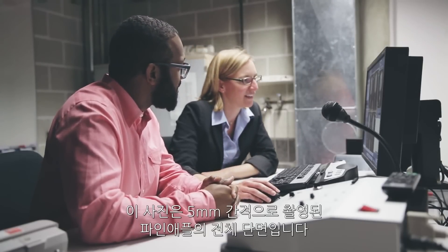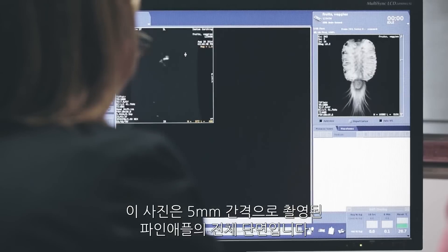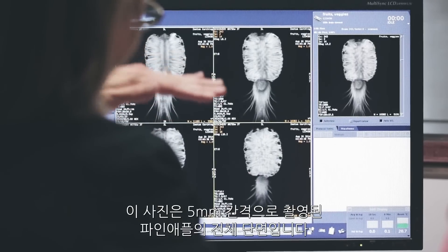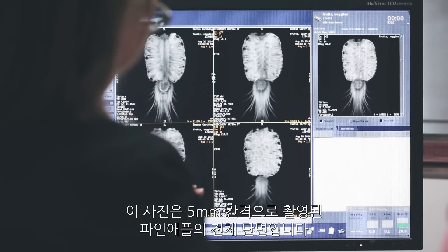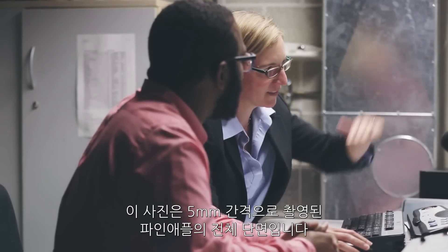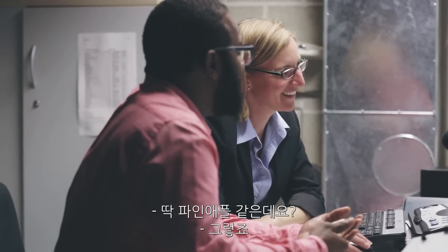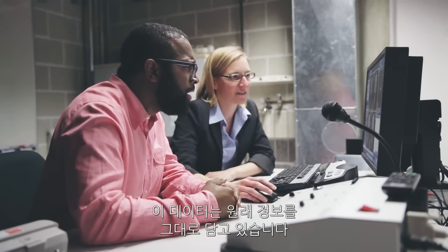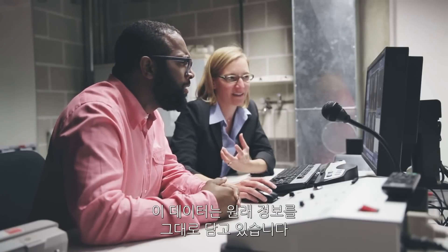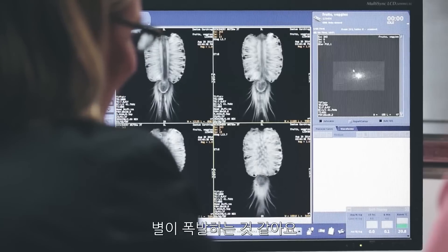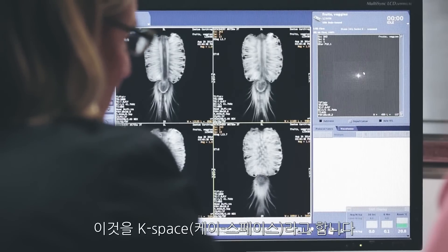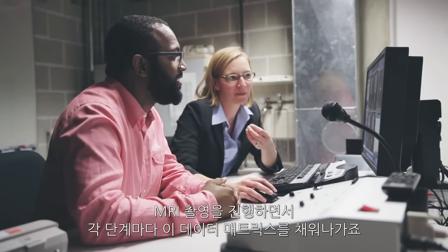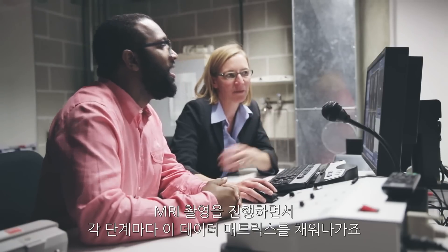So what you're looking at as I page through it is different slices — virtual slices separated by five millimeters from the top of the pineapple to the bottom. It looks like a pineapple. If you look over here, this is an image of the raw data that we're acquiring. It looks like an exploding star. We call this K-space, and this is the data matrix that we fill up point by point during the MRI experiment.